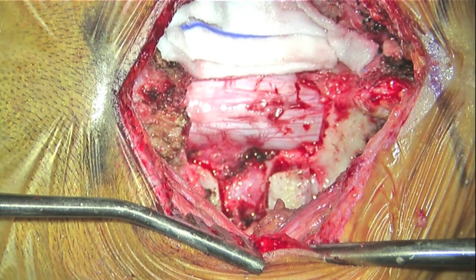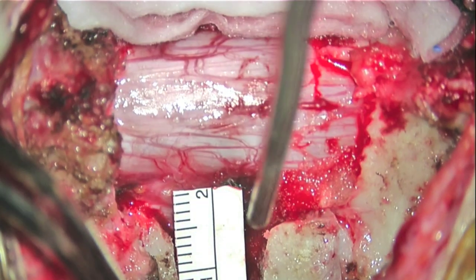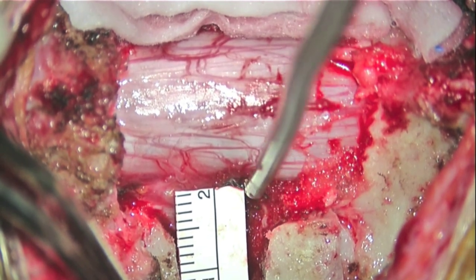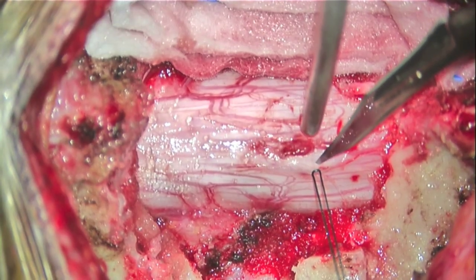A bilateral C3-4 laminectomy is performed, along with a complete left C3-4 facetectomy. As you can see, this posterior midline approach with facetectomy provides surgical exposure that extends 2 to 2.5 centimeters beyond the lateral dural margin. The dura is opened to the midline.